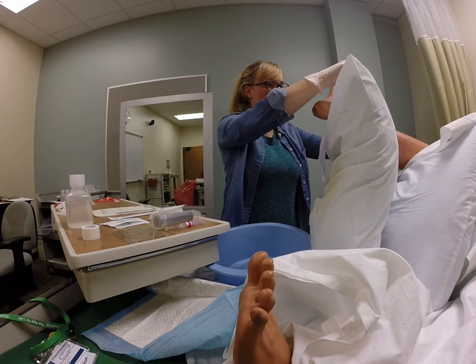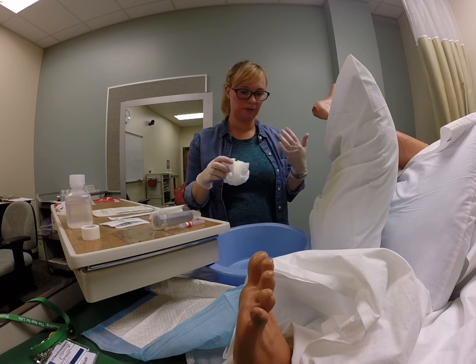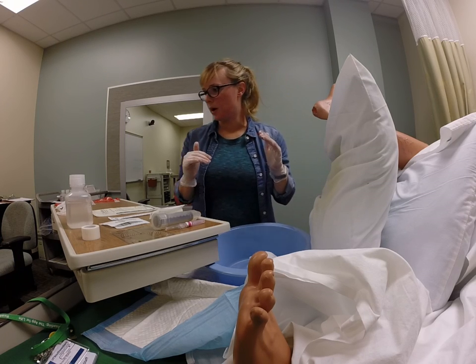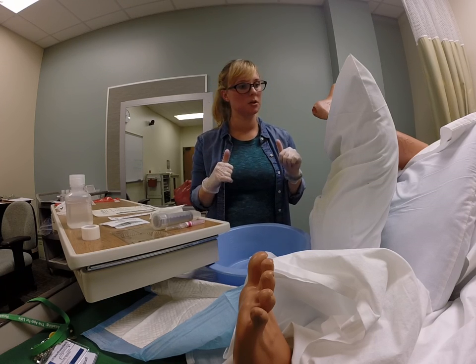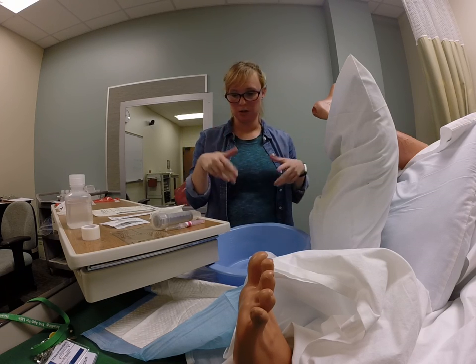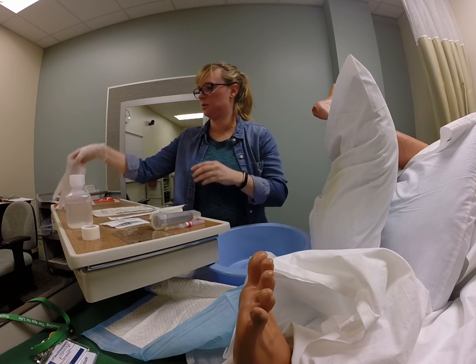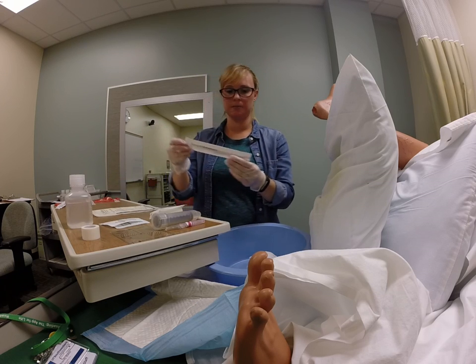Oh, no. Okay. Well, my packing just fell onto the floor. I'm actually going to leave it there, and I'll take note of what it looks like because since my wound's open, I don't want to bend down and pick that up, okay? So it's gross, but I am going to take care of it before I leave the room, okay? So remove those gloves. You can throw them in my trash can here or in my bucket. New gloves on. My Q-tips.